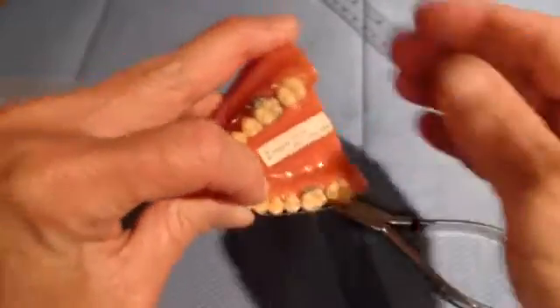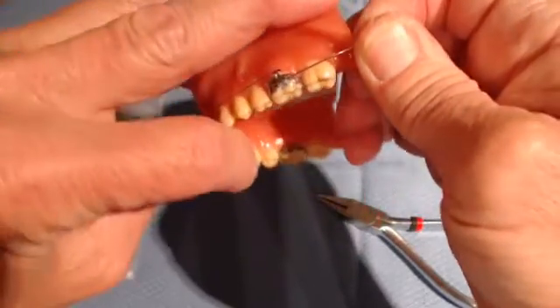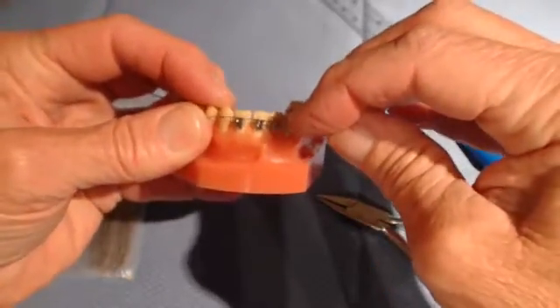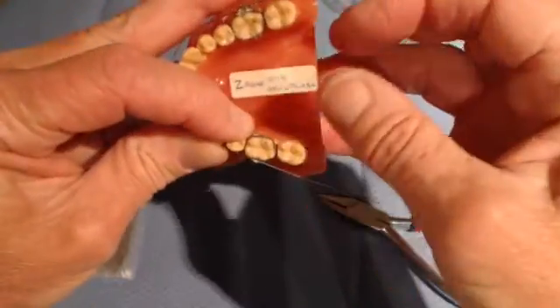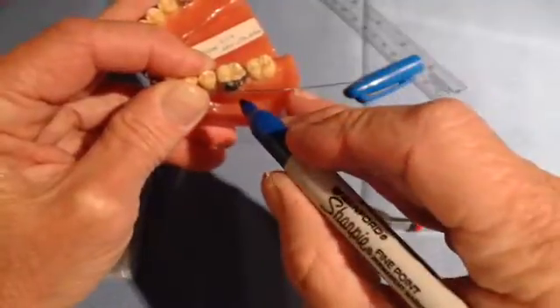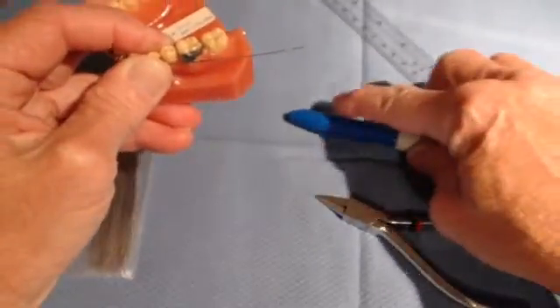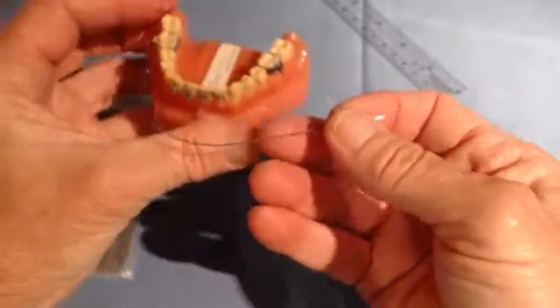Now we have to construct the other side. So you make sure that this end is butted up against the molar. Butt it up against that molar, put it into the slots, come around to the other side, and now you're going to mark two millimeters distal to the tube again — that is where the second bend is going to be made.